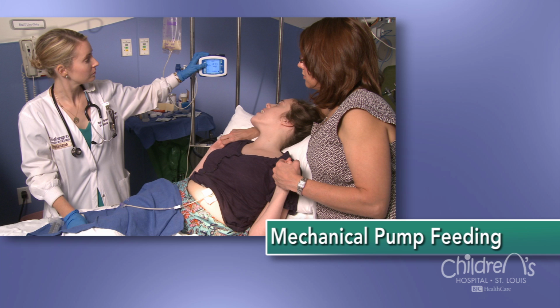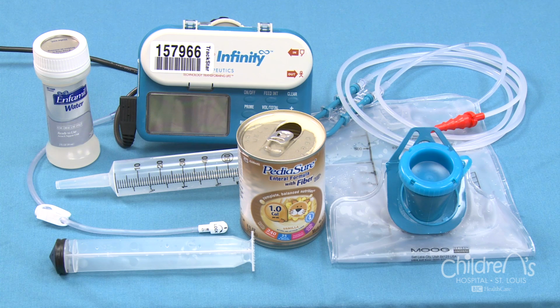Feedings delivered through a mechanical feeding pump can be continuous during the day or night, or they may run over several hours. To deliver a feeding using a mechanical pump, assemble your supplies first. You'll need a feeding pump, tubing, bags, formula, feeding syringe, water for flushing, and an extension set. Once you've assembled your supplies, follow these steps.